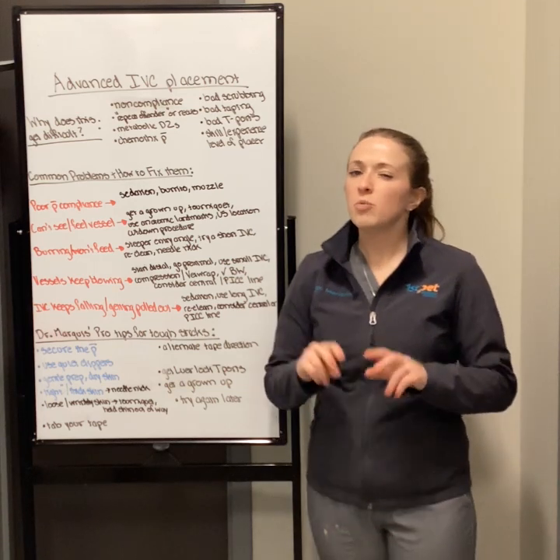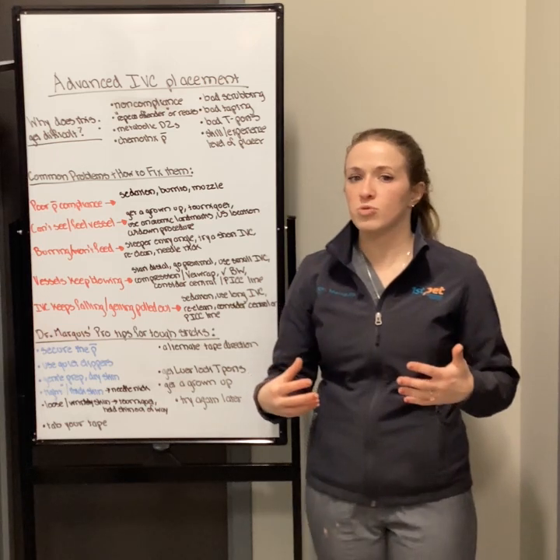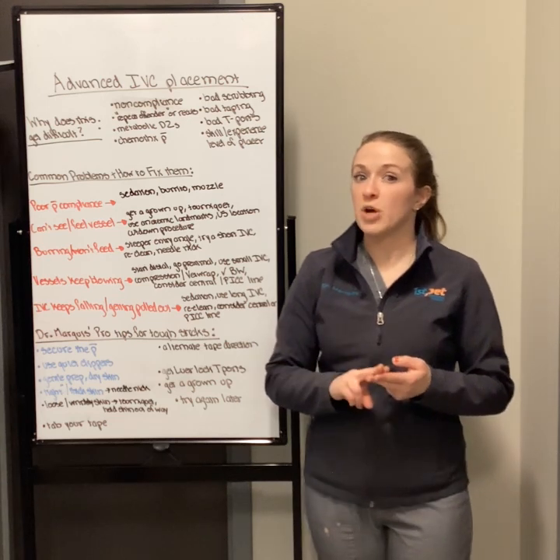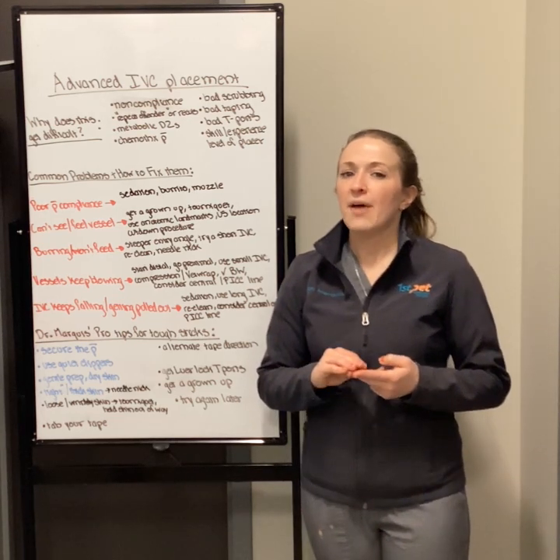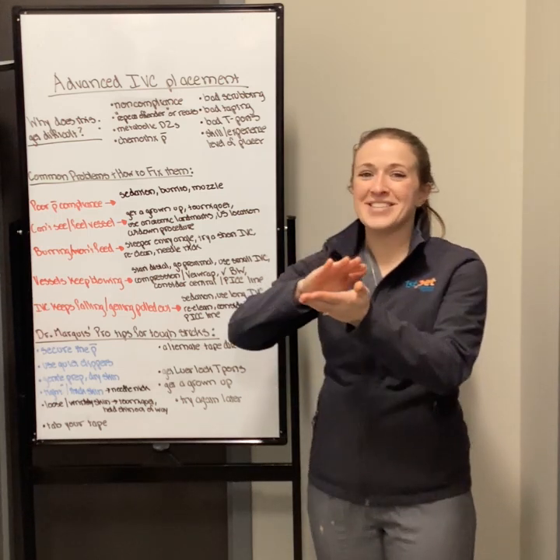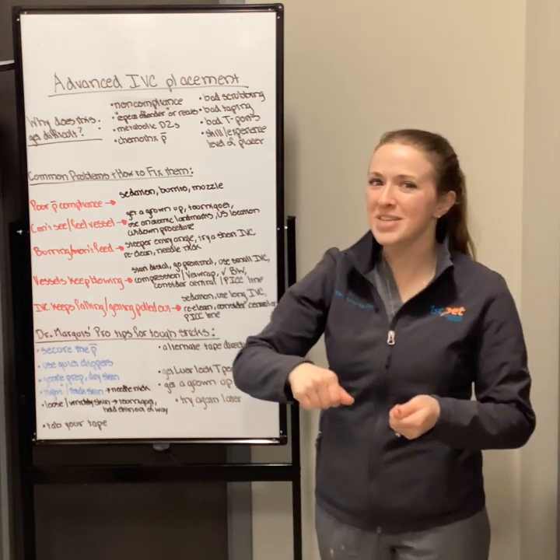For animals that have tight or thick skin, it can be very difficult to place catheters. An animal with tight skin is an animal that doesn't have a lot of wrinkles or extra skin. So I am talking about animals like Labradors, sometimes French bulldogs; hounds usually have tight skin, and their skin also tends to be very thick. Because the skin is not very mobile and kind of stays in place, what usually happens is that the catheter burrs going through the skin.